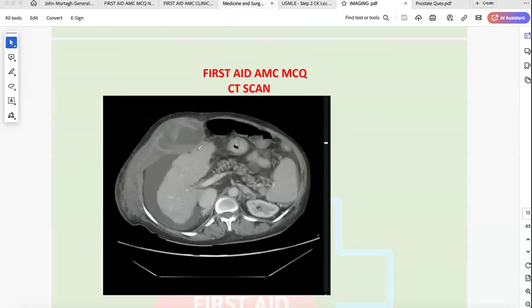So in here, this is called hematoma. And you might have seen these kind of questions quite often, that they give you a patient who is on warfarin and coming to you with a bit of abdominal pain in the middle of the tummy. And then you send the patient to the scan, and the scan shows a rectus sheath hematoma. So you compare, you can see this is the rectus sheath, and this side on the right hand side, this is what we call rectus sheath hematoma, which you would not get on the other side.